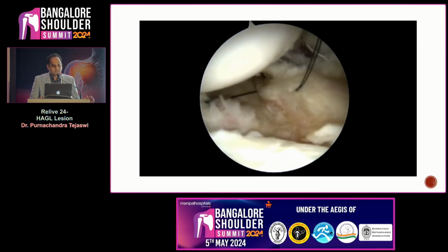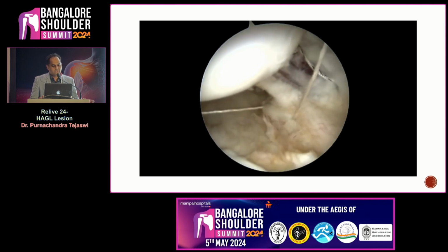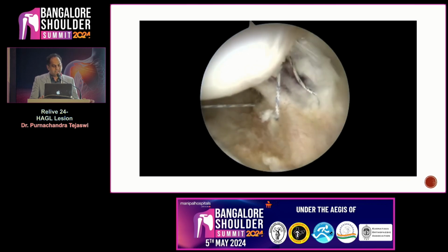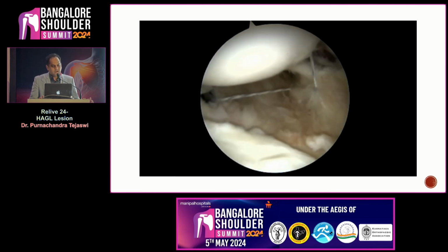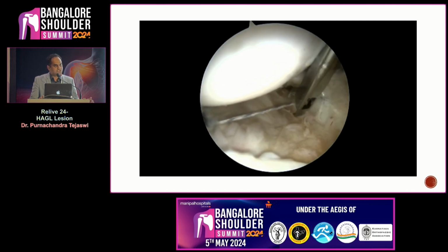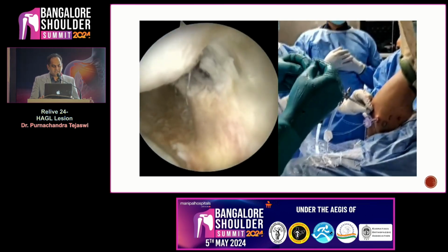Once this is done, this anchor has 3 sutures. One is called the repair stitch, which is shuttled into the lasso and posteriorly, and all the sutures now are taken into the anterior portal, both the repair stitch and the shuttle stitches. The repair stitch is shuttled so that it engages the tissue into the anchor and locks it. So that is how it is done.